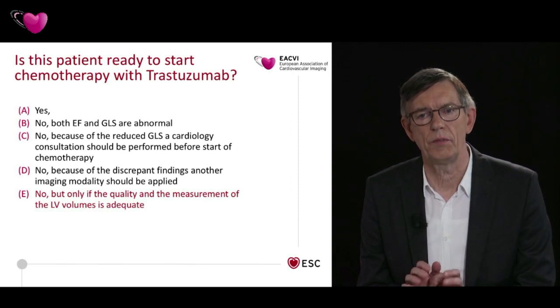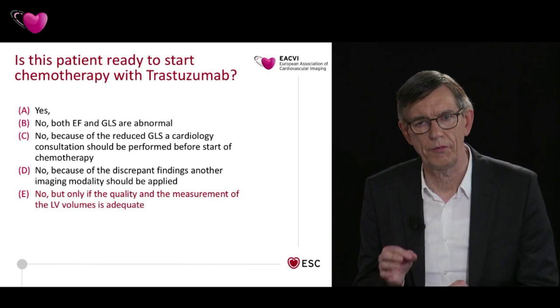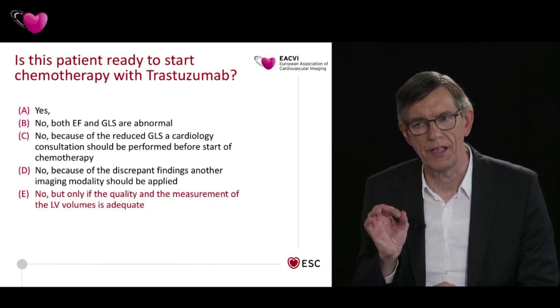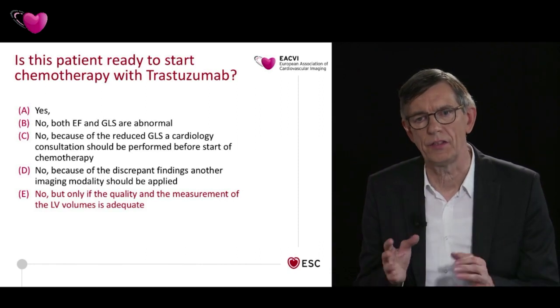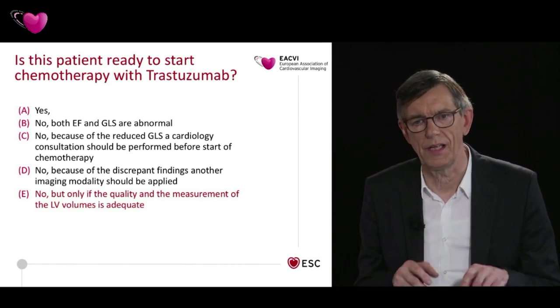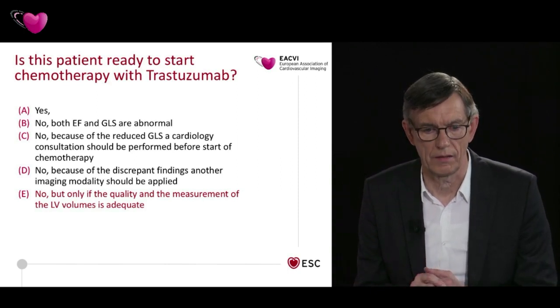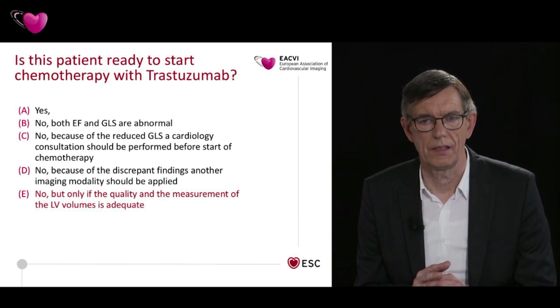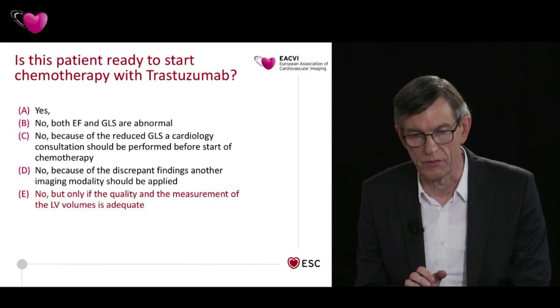I think before we make any statement about the values, we have to give also a statement about the quality. We often forget that, but in these patients, I think it's very important that we say, also in our reporting, these are high quality recordings, and we think this is supporting our results.